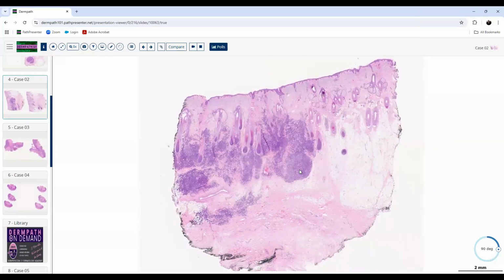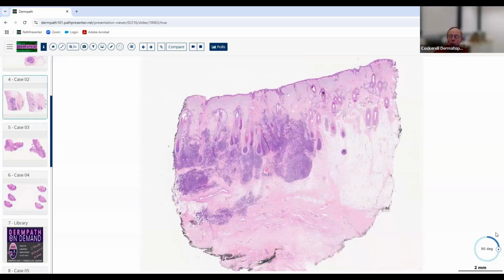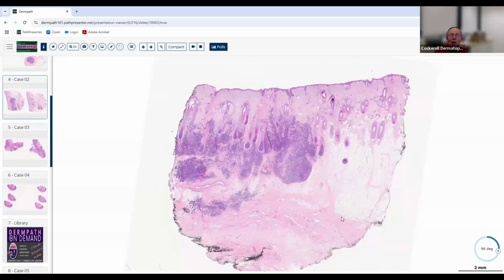All right, so we're examining here a punch biopsy. These are great examples of good biopsies for you guys this morning. These are large chunks of tissue, not the usual fingernail biopsies. We got a nice big piece, and that's what you're going to get on the boards too, by the way. They're not going to give you little garbage things. They're going to give you things like this that you can sink your teeth into.